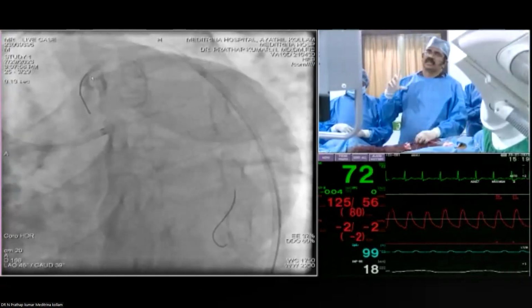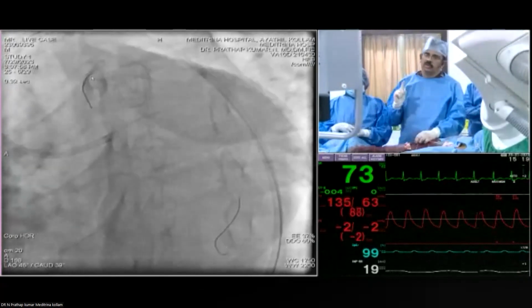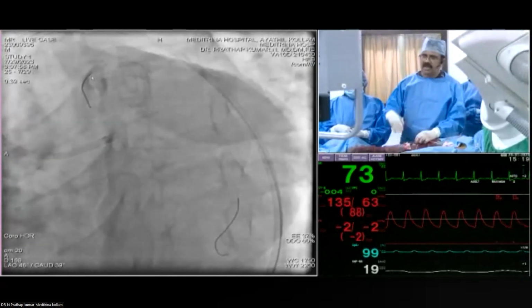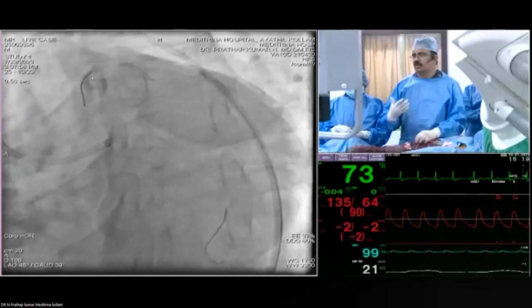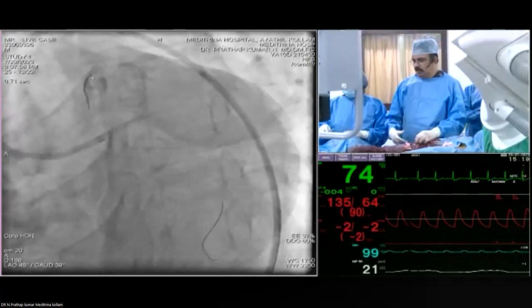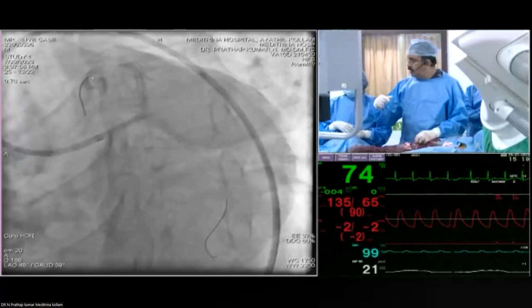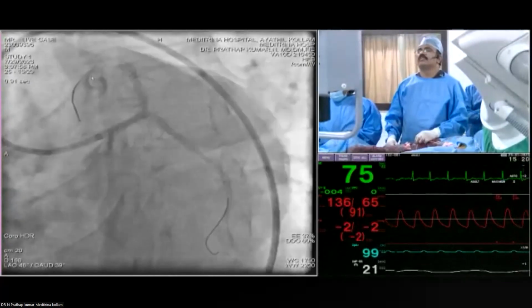So when you do a circ stenting, the stent strut will definitely protrude into the LMCA. So the two stent struts, this present stent strut and the previous stent strut protruding into the LAD, I don't think it is a good suggestion at all. I'm not sure, but you have to perform final kissing with NC balloons. No doubt about that. What do you think?